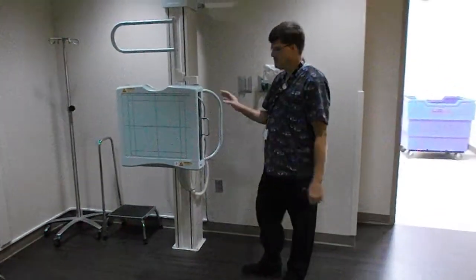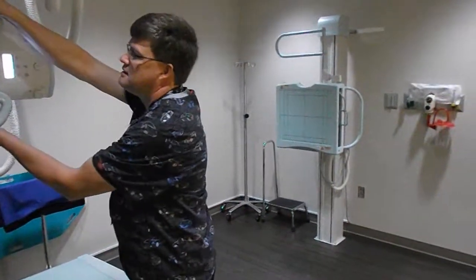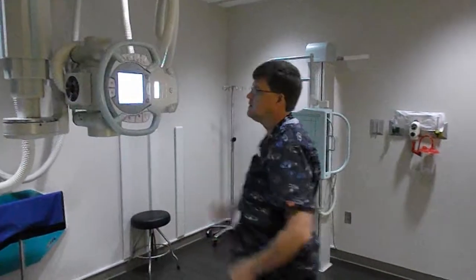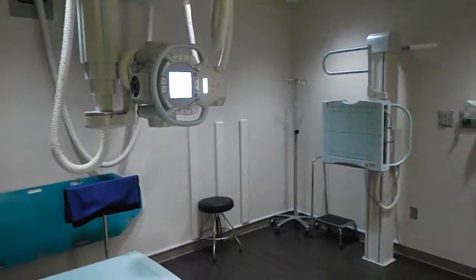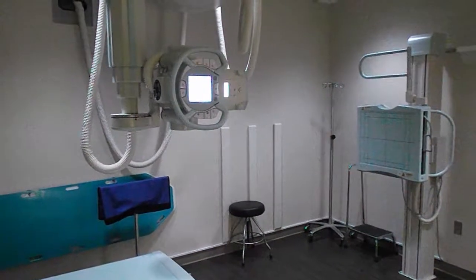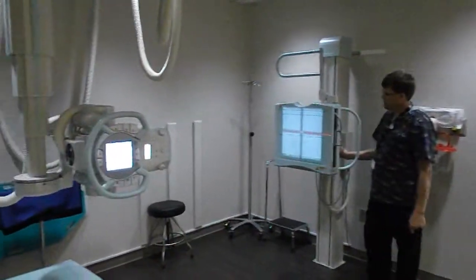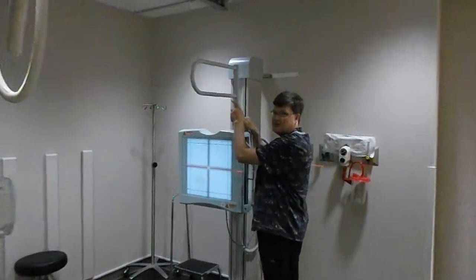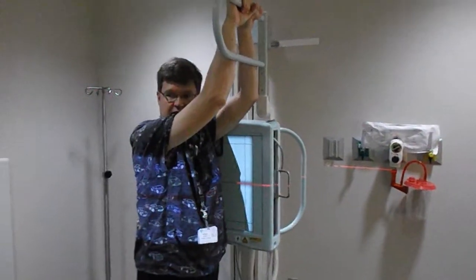This over here is the wall bucky. It can move up and down here. We can have it all set up to the wall bucky, and there's also a button back here — it'll move the tube right there and line it up for you, which makes it really nice to use. We also have this handle up here — so if you're going lateral, they have something to hold on to. It makes it a little easier for them to get their arms out of the way and also stay more still.